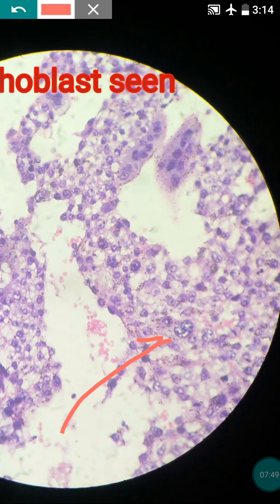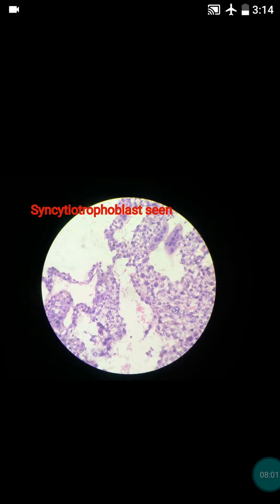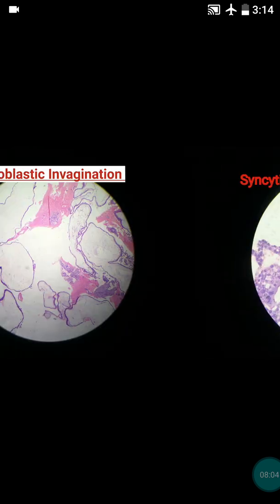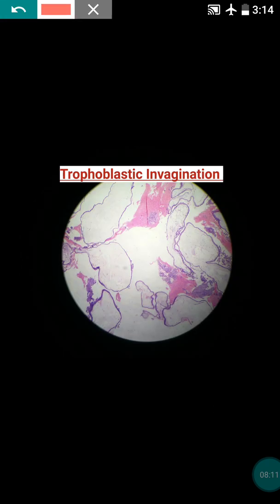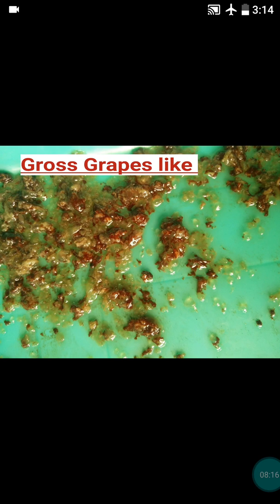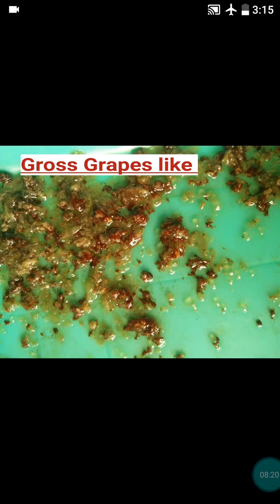Moving forward, you can also see certain syncytiotrophoblast — these are the multinucleated syncytiotrophoblast. Marked cytotrophoblast proliferation is present. Some cells show atypical features — this enlarged cell shows atypia — these are the intermediate trophoblast that can be seen in complete hydatidiform mole. Sometimes trophoblastic invagination can also be seen.